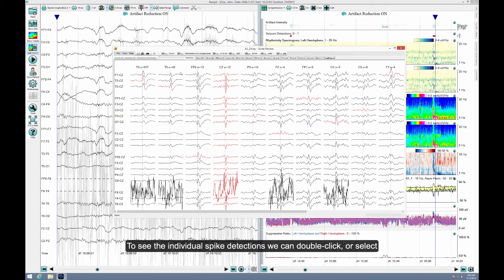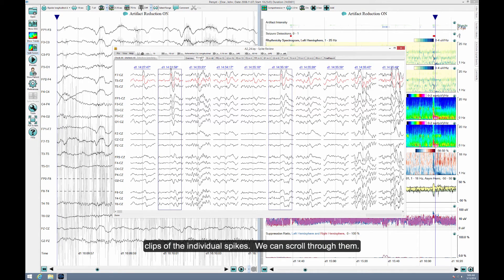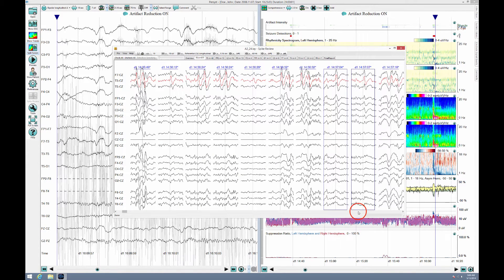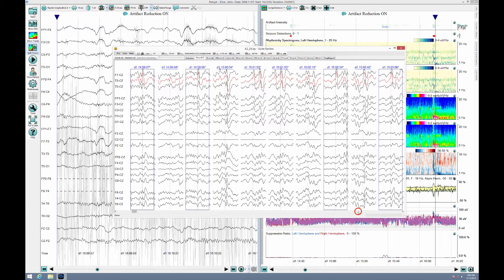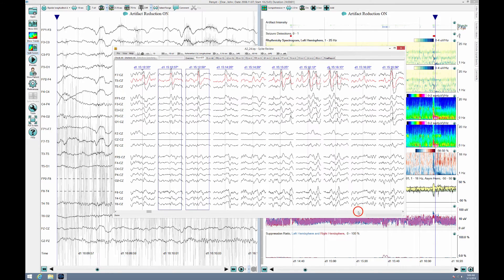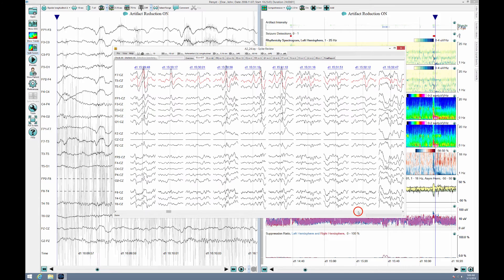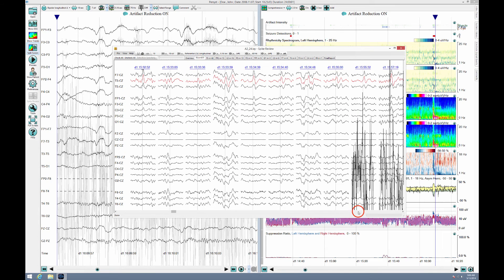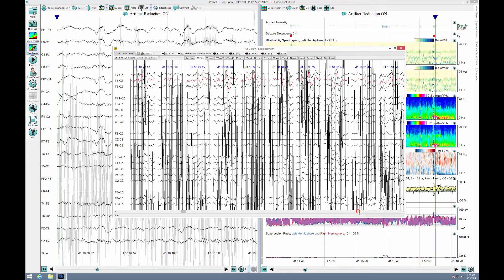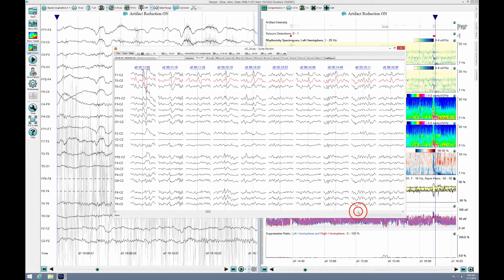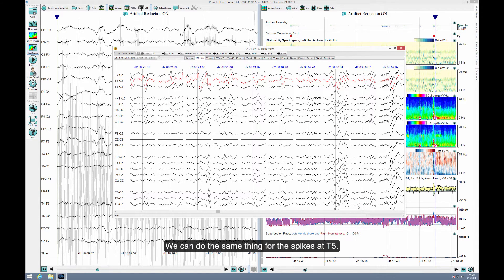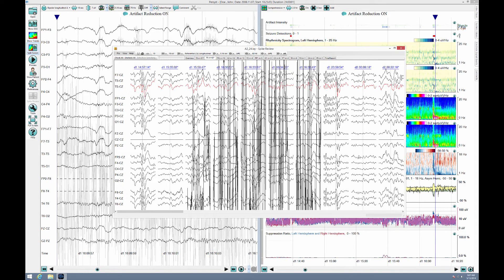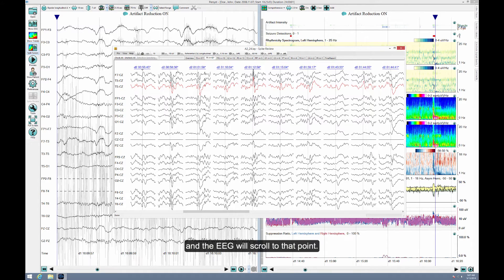To see the individual spike detections we can double-click or select the tab for that focus. These are the clips of the individual spikes. We can scroll through them. We can do the same thing for spikes at T5. To see the spikes in the EEG we can click on the time and the EEG will scroll to that point.